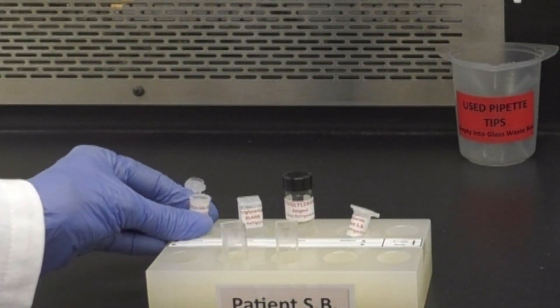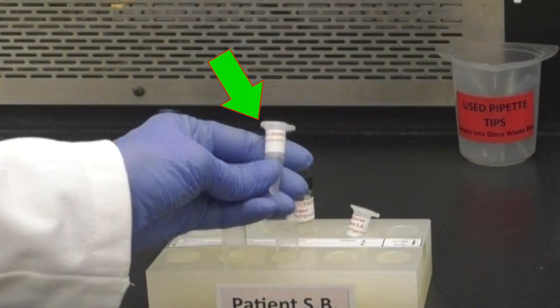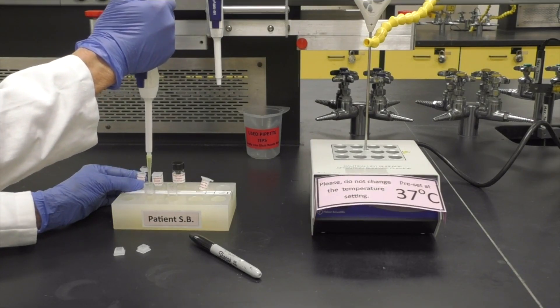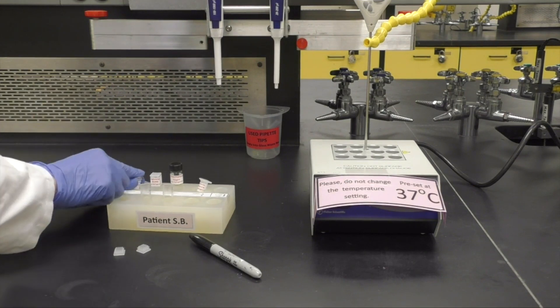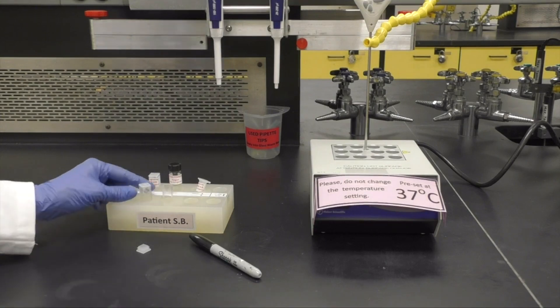Next, open the triglyceride standard microfuge tube by pushing up on the little tab in the front and add 20 microliters to the cuvette labeled as standard. Cap it and place it in the dry bath incubator. Allow it to warm for 10 minutes.